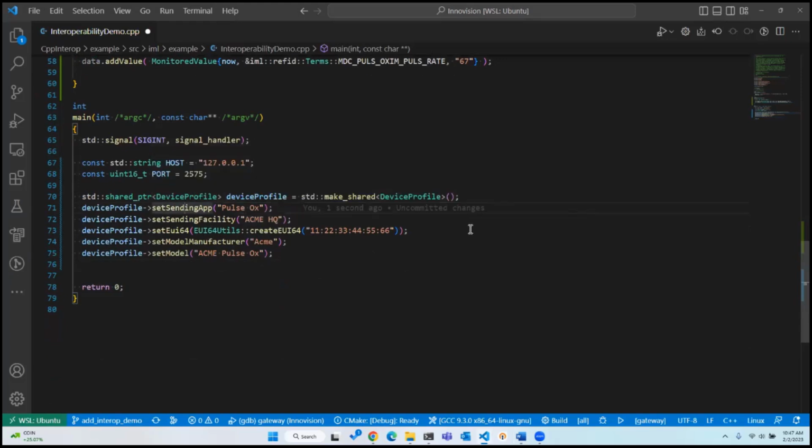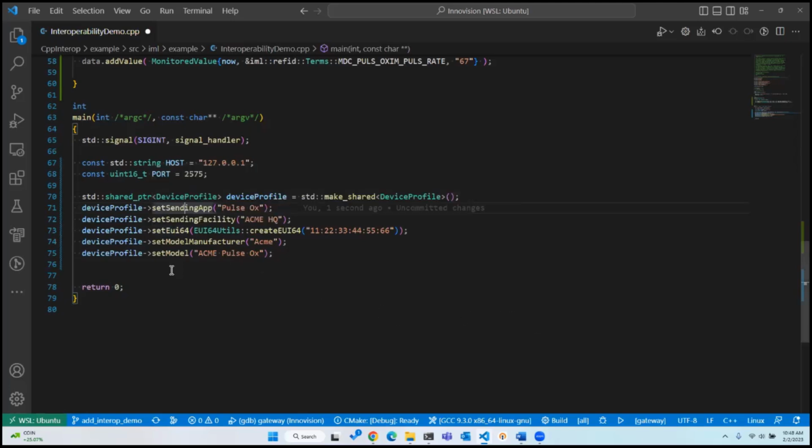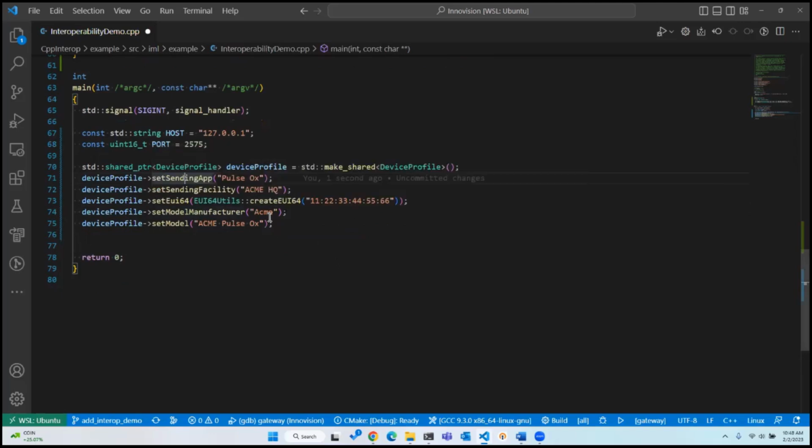So our sending application, pulse ox, that uniquely identifies our application from any other application that the super EMR might be receiving data from. Next, the sending facility. So that's the organization responsible for our application. So I'm just saying in this case, the Acme HQ, their headquarters, is responsible for our pulse ox device. Then we have the EUI64, that's our device ID. And then our model manufacturer, Acme, and our model, which I've just said is the Acme pulse ox.